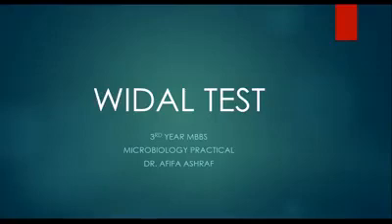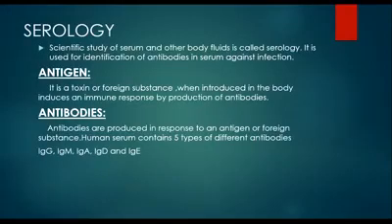The topic for today's practical is Widal test. Before coming to the main topic, let's discuss some of the definitions. Serology. The scientific study of serum and other body fluids is called serology. It is used for the identification of antibodies in serum against infection.